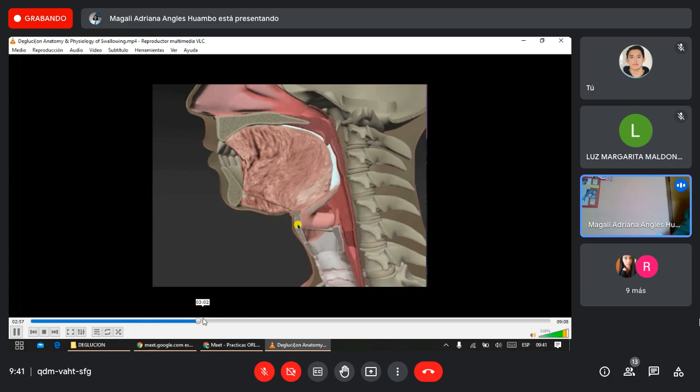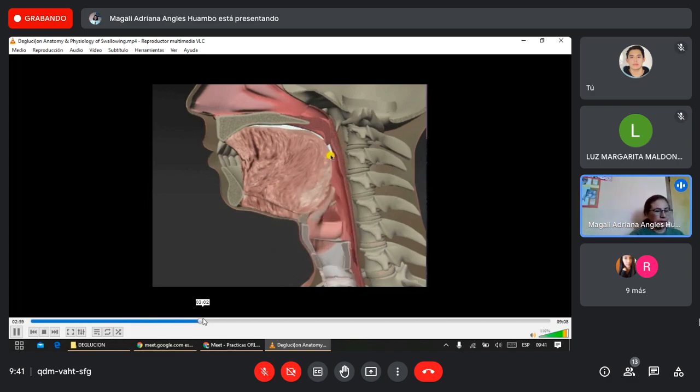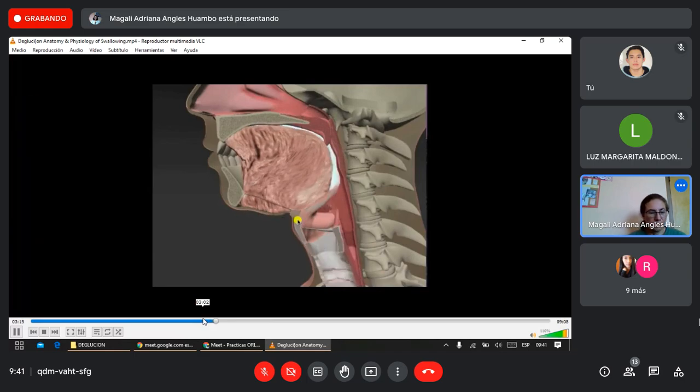And then what happens when the head of the bolus is at about the region of where the mandible intersects the back of the tongue, you'll start to see the first brisk superior hyoid movement right there. And at this point, on this particular swallow, the head of the bolus is actually in the vallecula. So then we're going to progress on here. So when the pharyngeal swallow initiates, then you're going to see this whole cascade of movement, right?